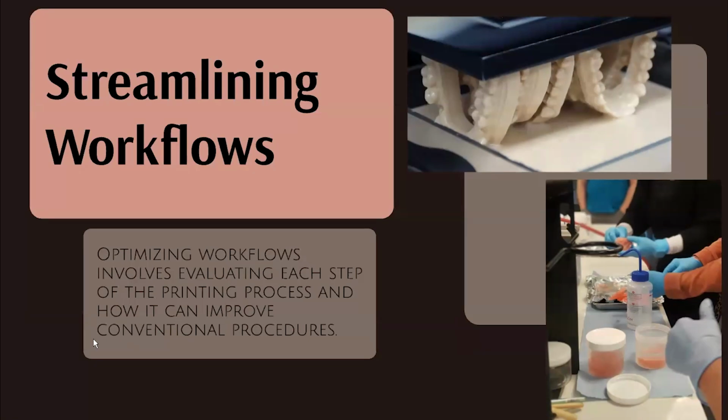So you've got to optimize those workflows. It doesn't always mean it's the case. Sometimes I realize I just spent so long designing maybe an acrylic partial, and I could have salt and peppered it in about an hour. Sometimes it's better to stick to old school, but not often. Most of the time, the digital workflows really help.